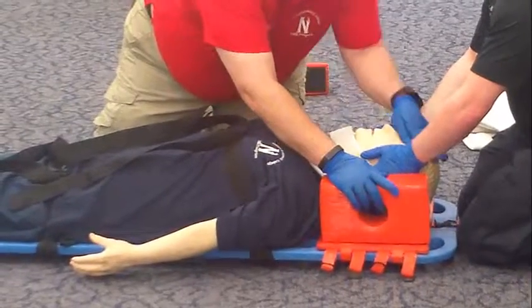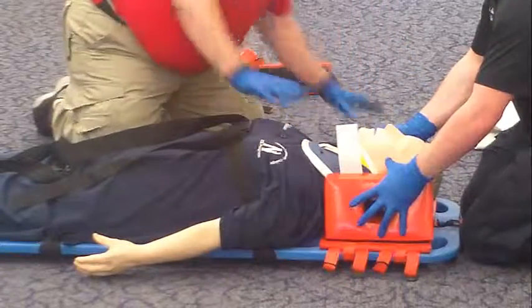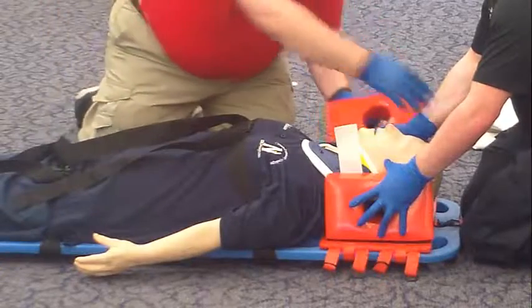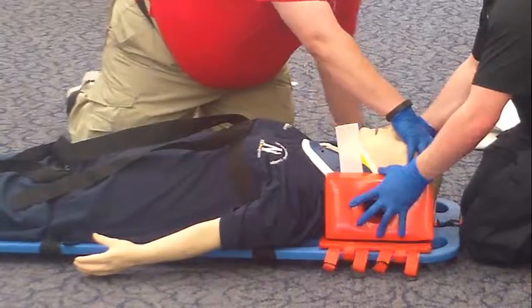Apply the head blocks. I have the head — you can slide your hand out to grab the outside. We shall do the same to the other side. Slide your hand out. I have the head — hold the head, please.